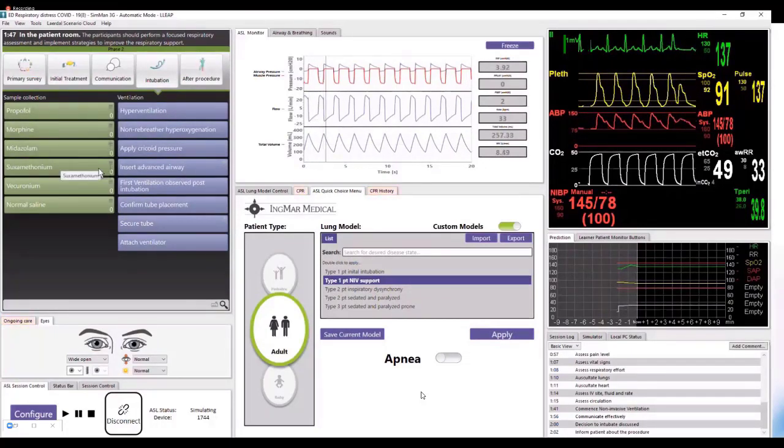We just pause there for a second. You'll notice that all of those medications have actual events listed in behind the scenes so that we can actually see a response. If these aren't the medication that you use in your clinical area, you can change these in the scenario later.